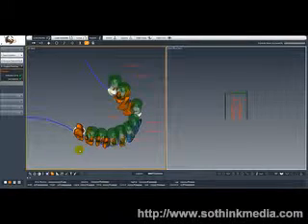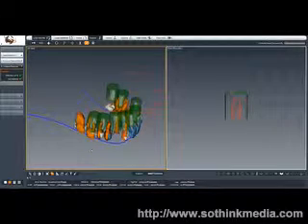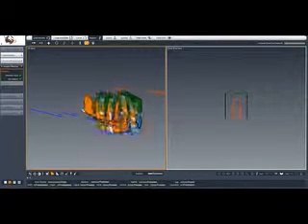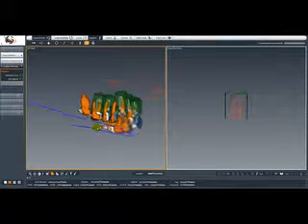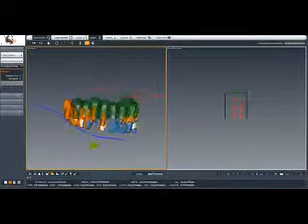There's no interseptal bone, so placing the implant on tooth number 3 right in the middle of the interseptal bone is going to be much better to get much better stability. And since we're going to be doing a sinus lift, instead of using an 11.5 we could use a 13. Even instead of a 10 on number 4, we could use an 11.5 or a 13 as well, since we're going to be doing a sinus graft.